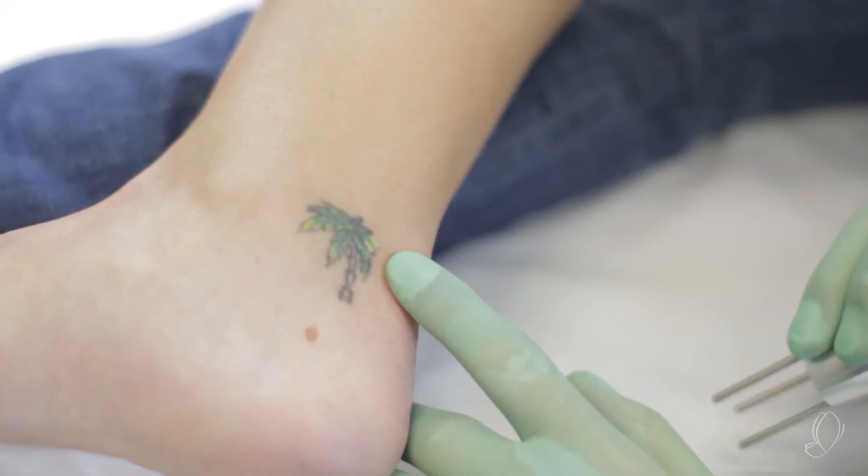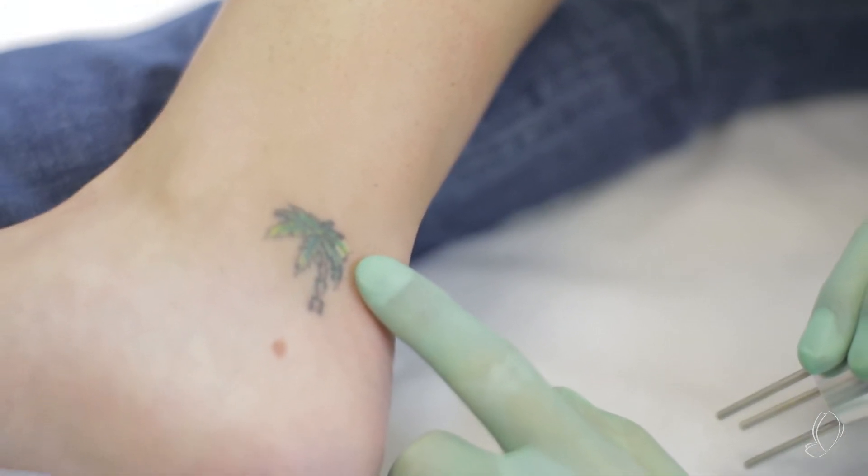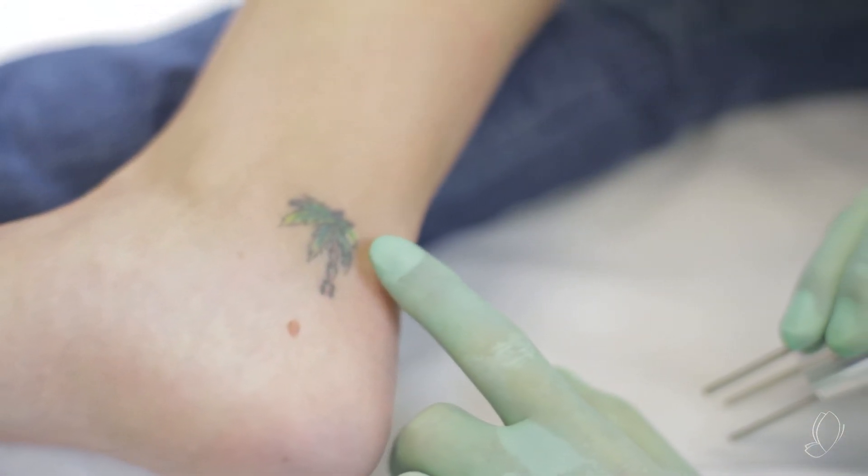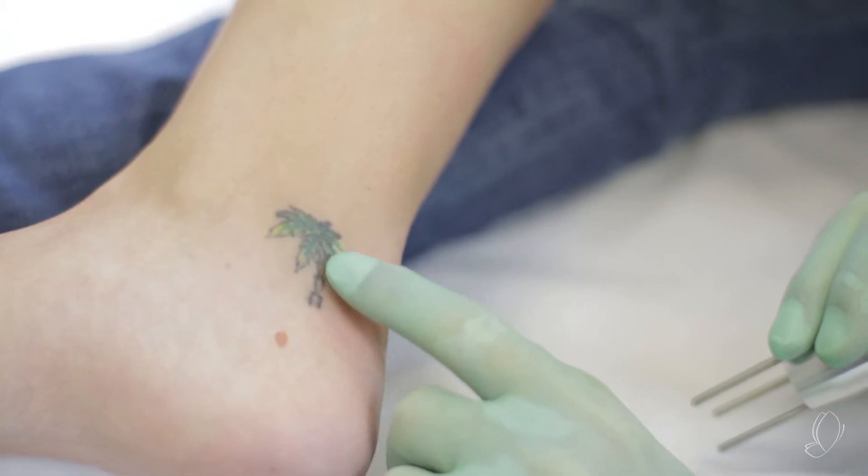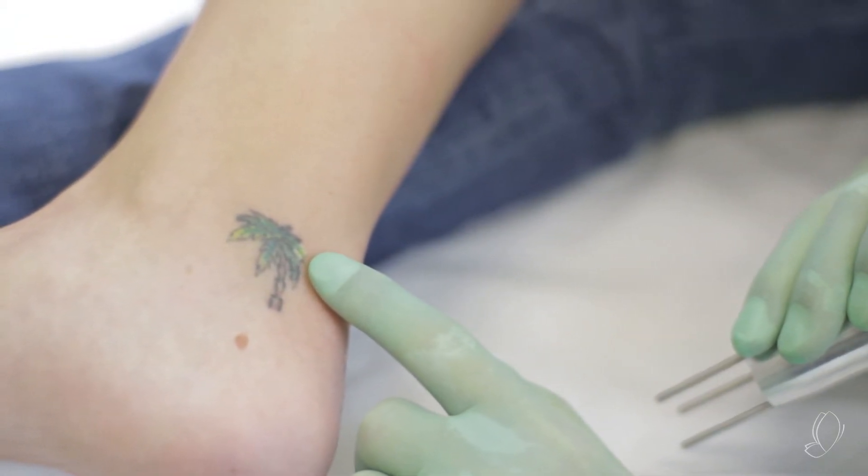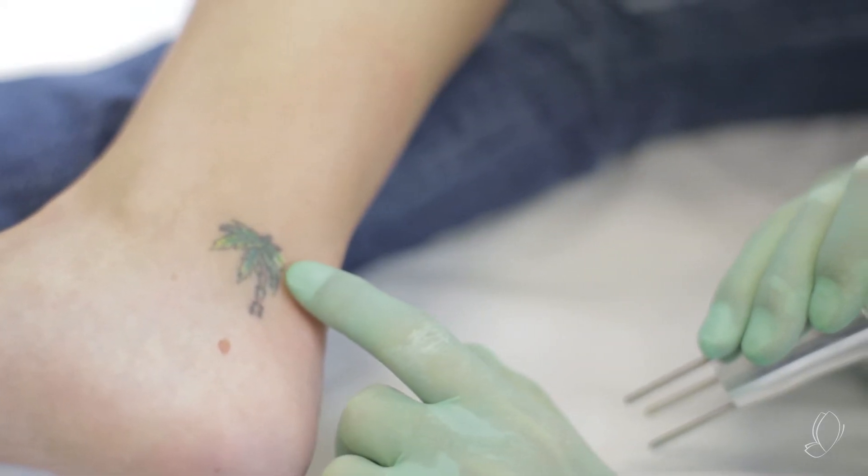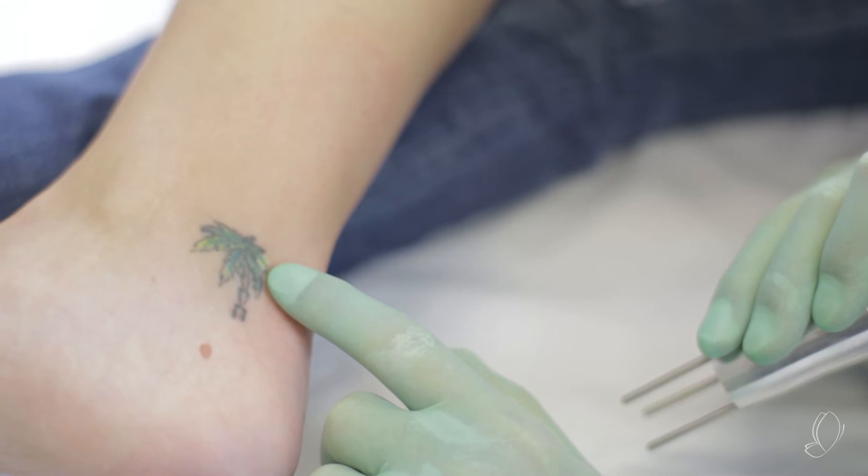So one of the things that's really interesting here is you'll see that we're using the 1064 wavelength. That 1064 on the outline where we'd expect was incredibly well absorbed, the black outline of the palm tree. The inner part of the tree, which was filled with green, which would really be best absorbed by a 694 ruby wavelength, you can tell that it's still almost untouched ink.